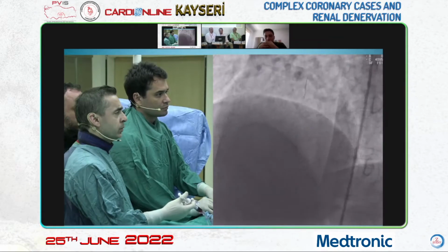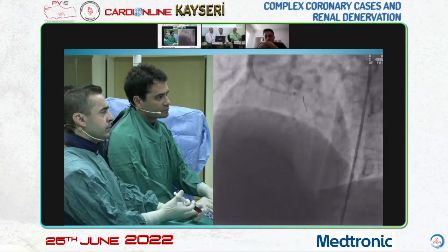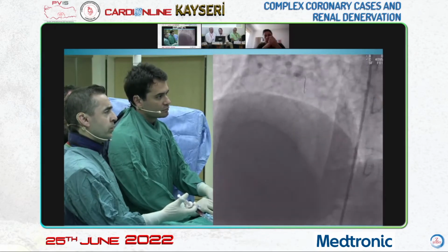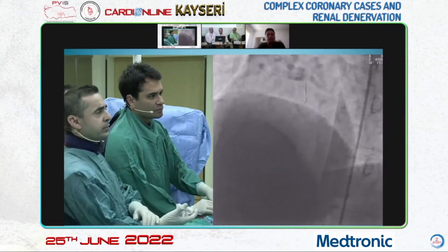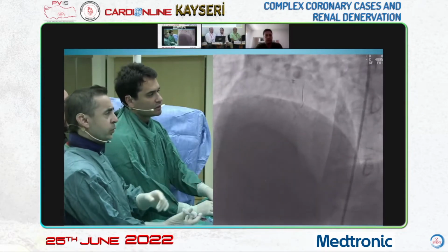A Pilot wire can be used. There are micro channels, and next, after passing the lesion, if we have the chance for IVUS, the distal of the lesion may be evaluated, and then for intervention, it may be better. I agree with Nihat about this.